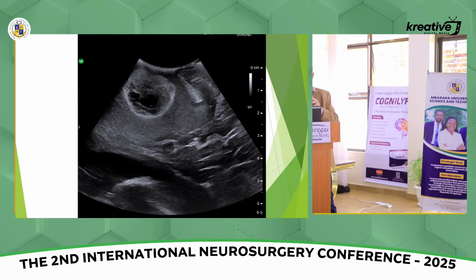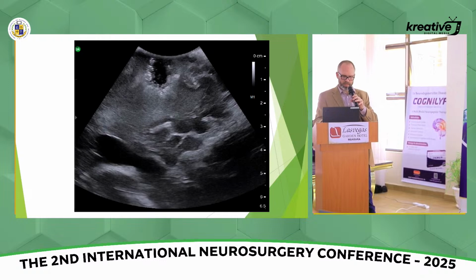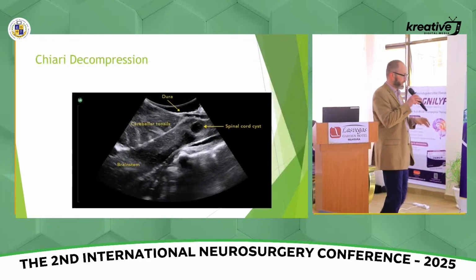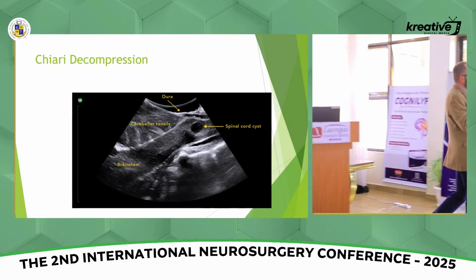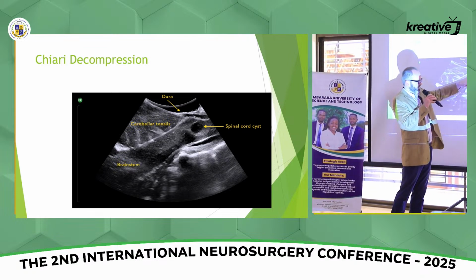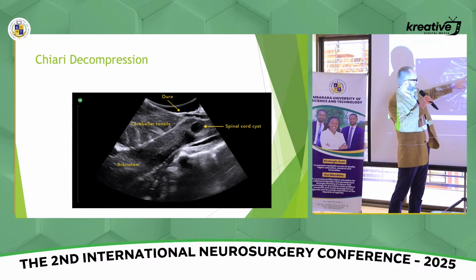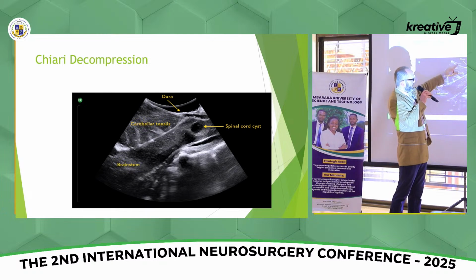Okay, this is another brain abscess case, and this is a Chiari case, so Chiari decompression. You can appreciate the cerebellar tonsils here, and upper cervical syrinx. This is the brainstem and the spinal cord, and this is the dura.